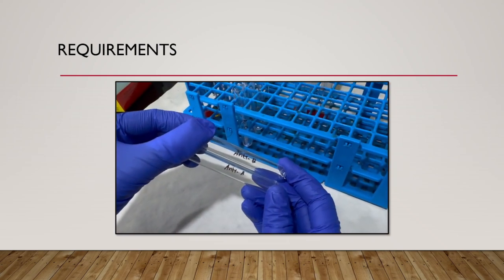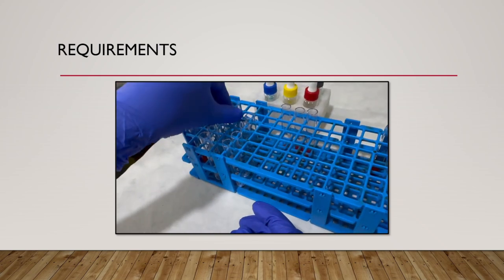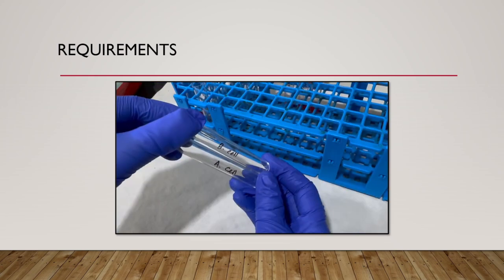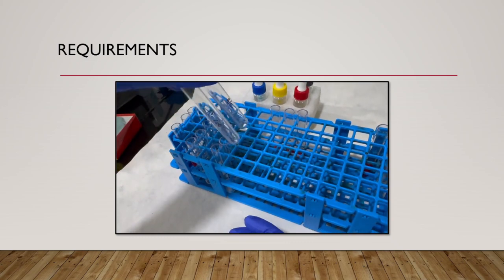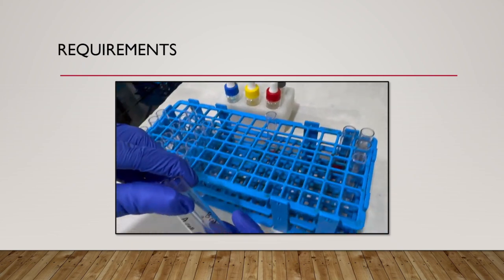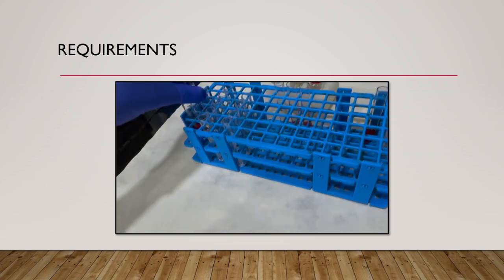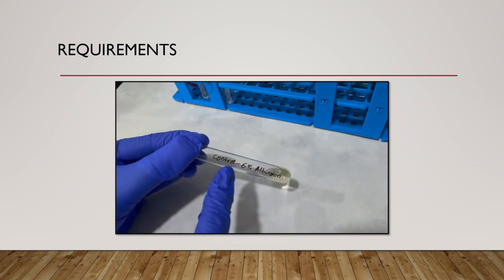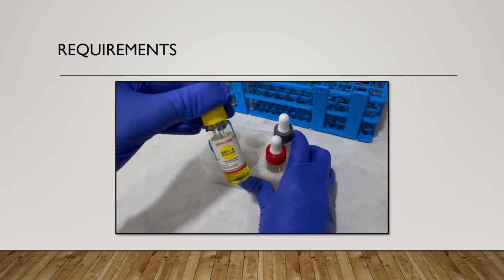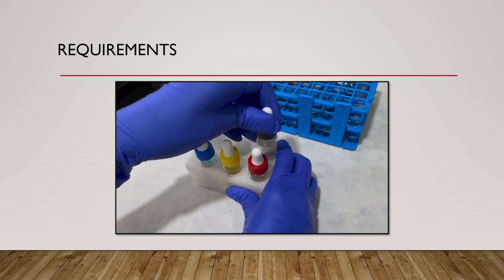For forward grouping, we have tubes for anti-A, anti-B, anti-AB, anti-D, and as control we have taken 6% albumin to analyze if there is any RBC isoagglutination. For reverse grouping we have tubes for A cell, B cell, and also O cell and auto control. These are the pooled A cell and B cells. This is the patient RBC and patient serum. There is a 3% RBC suspension we had made. This is the control 6% albumin. These are the commercially available anti-A, anti-B, anti-AB, and anti-D solutions.